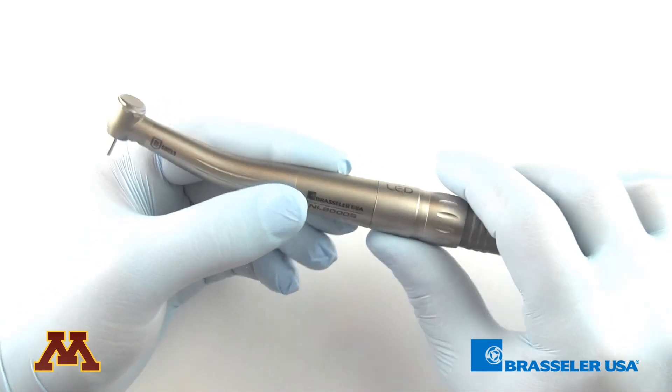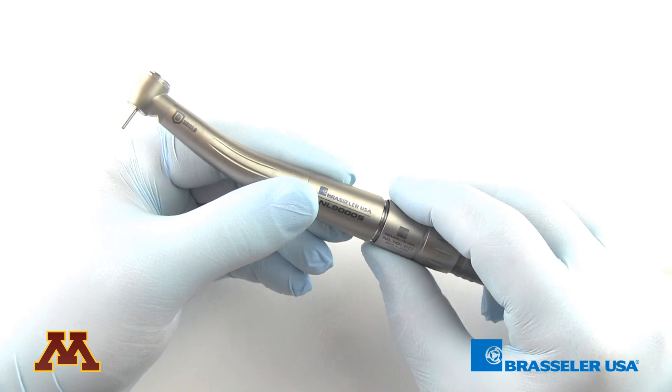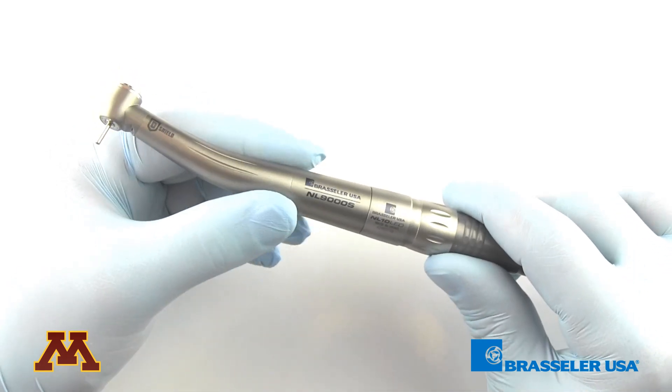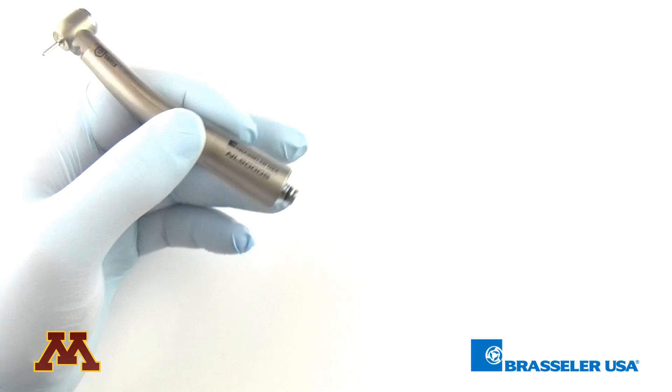Now when it's time to remove the high speed, what you want to do is pull back on this little lever on the coupler. When it pulls back, it allows the hand piece to release. If you simply pull on the hand piece, it's not going to release from the coupler. So you pull back on the lever and the hand piece comes off.